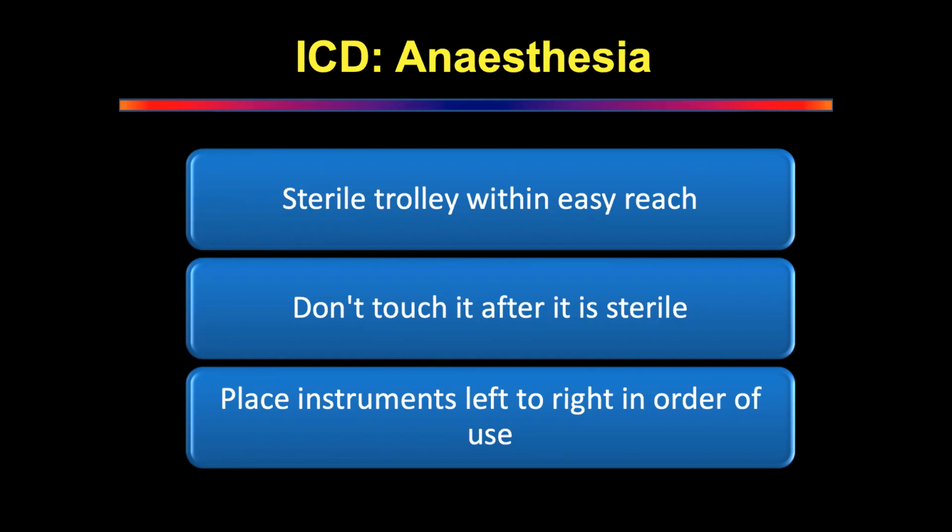How do you mark? Ultrasound guidance. I'm going to use ultrasound. So even before you give anesthesia, keep talking about ultrasound. Very important. And the ultrasound should be draped with a sterile cover, a sterile sleeve. Very important. The ultrasound probe should be draped with a sterile sleeve. So it is real-time ultrasound.